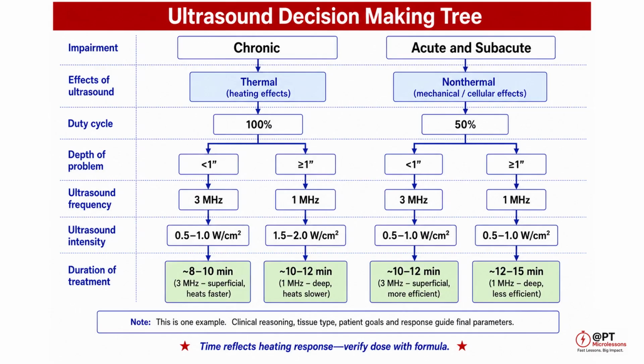In most cases, you should be treating an area that is about 2 to 3 times the size of the sound head. For a small treatment area like this, you can use the time ranges shown in the chart. However, if you are treating a larger area, the energy is spread out over a greater region, so you will need to increase the total treatment time.